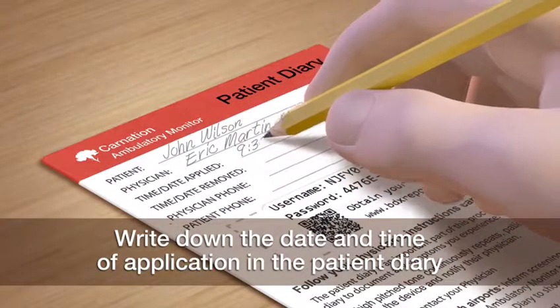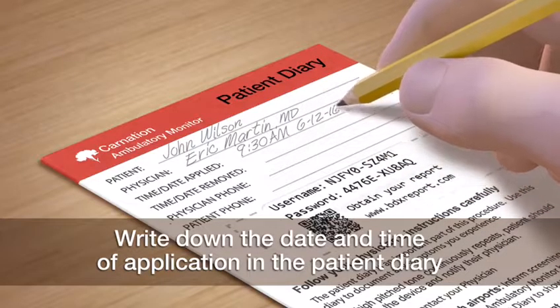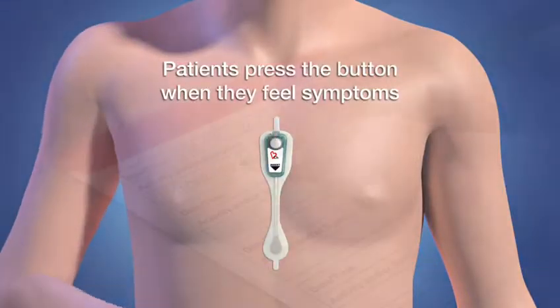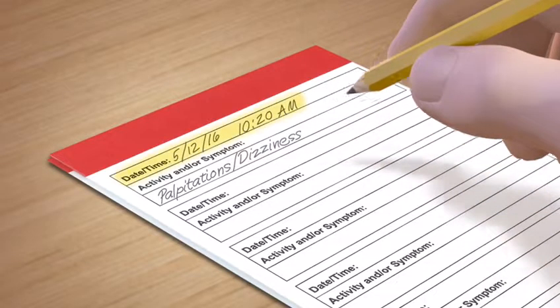Write the date and time of the application in the patient diary. To record symptoms, the patient should press the button once and write the symptoms in the patient diary, being sure to enter the time and date.